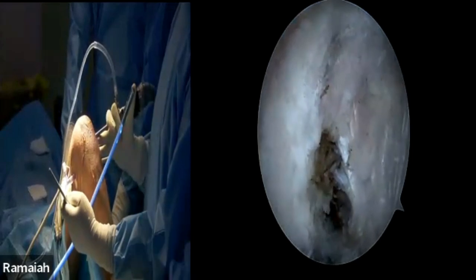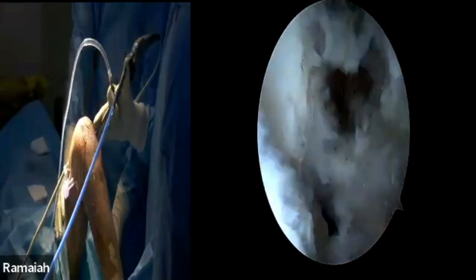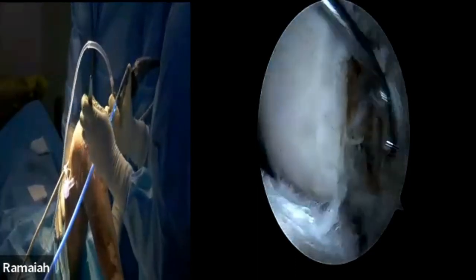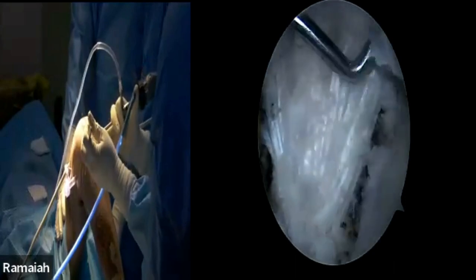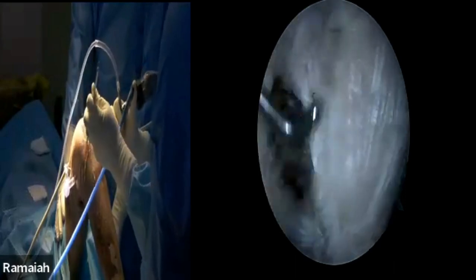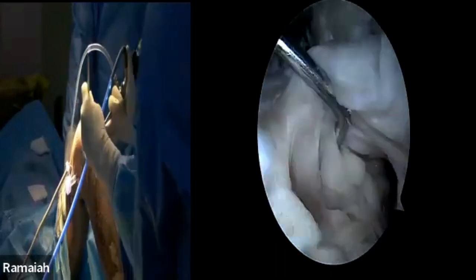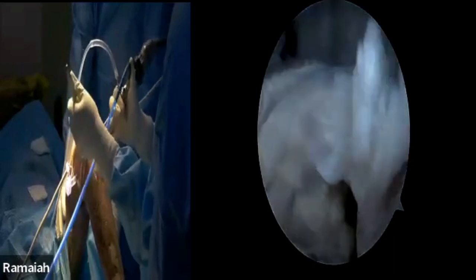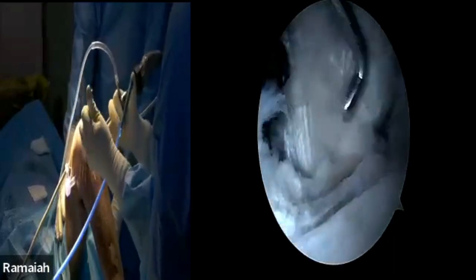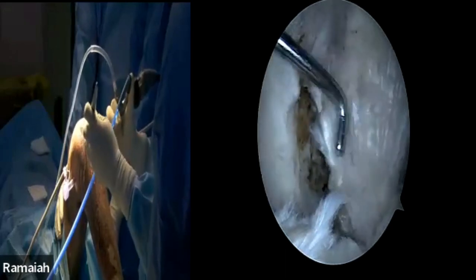I've already harvested the graft. This is the posteromedial cannula you're seeing. I took the telescope into the posteromedial window — what I call window one — between the medial femoral condyle. You can see the remnant of the PCL, which is completely intact. I have not destroyed it, just to give orientation. This is also the ACL. It's a tough cadaver — tissues are quite hard.